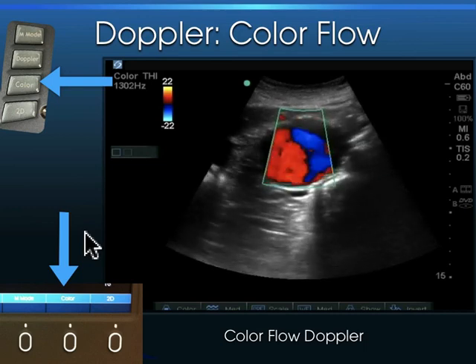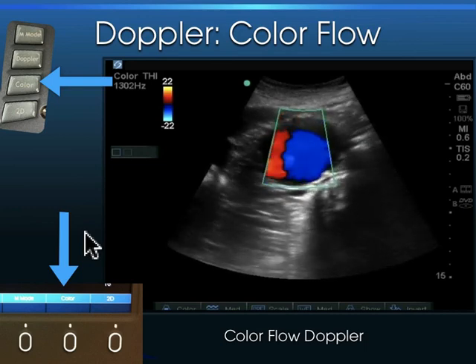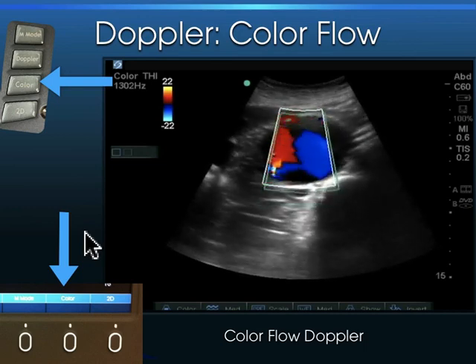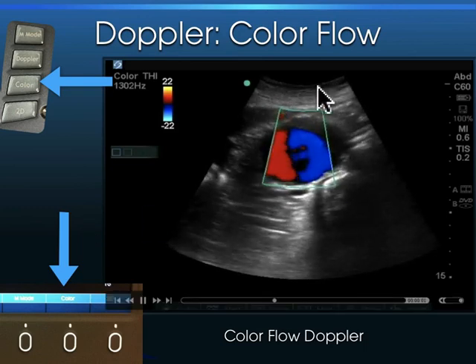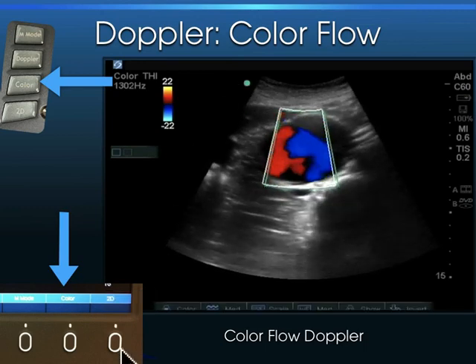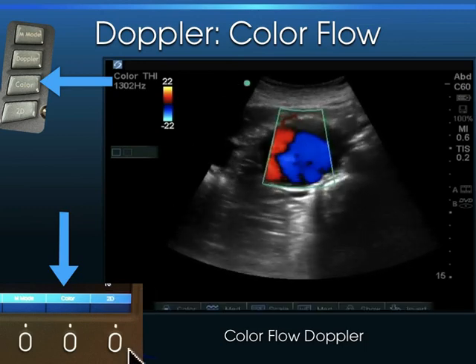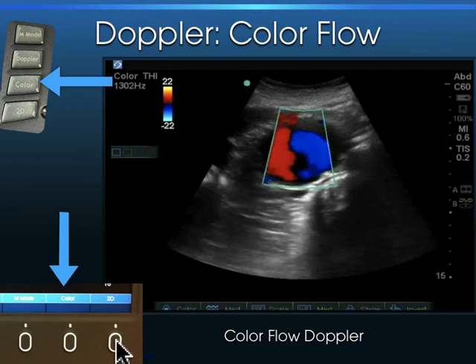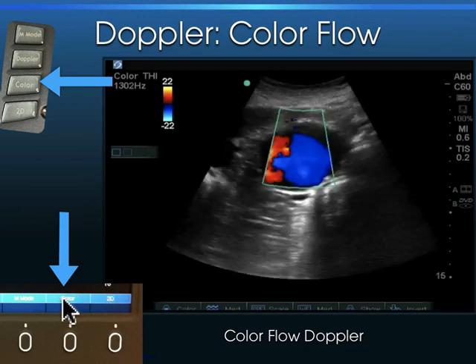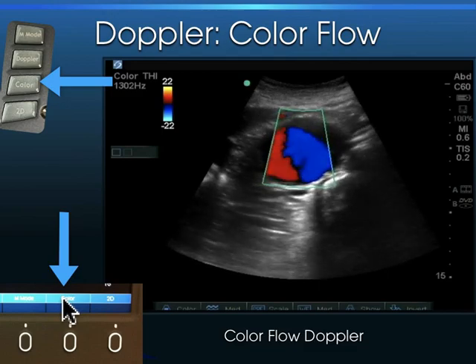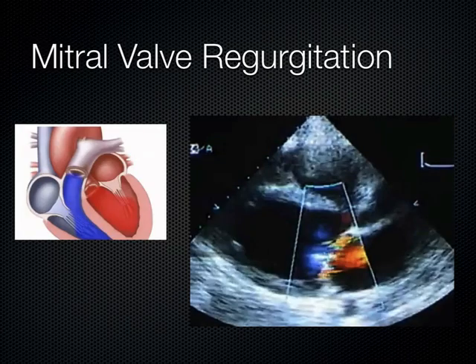Yes — the top of the screen is the transducer. Correct. This is the skin line, the footprint of the transducer right there. The way we activate this flow: we come down here, hit mode — there's 2D, which is just brightness mode, and there's color. You activate color, and then this color box — this sampling gate — pops up on the screen, and you place that over the valve.